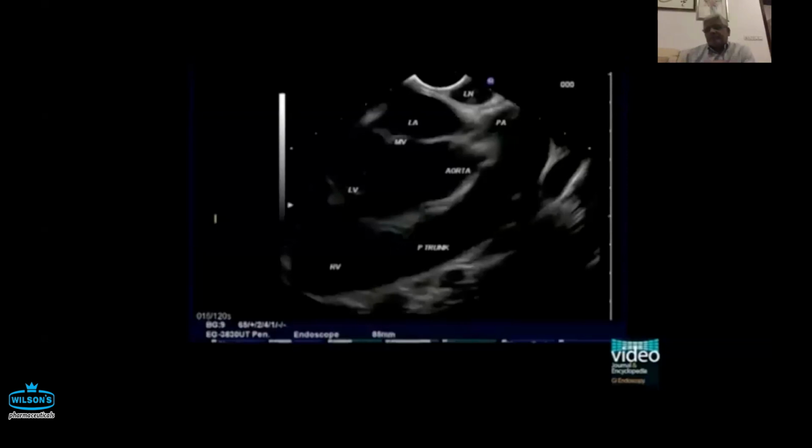I think if you have a large lymph node which is more than 1 centimeter in the shortest diameter, it is rounded, it is hypoechoic, that's usually abnormal. But then it's accurate in 80% of the cases.